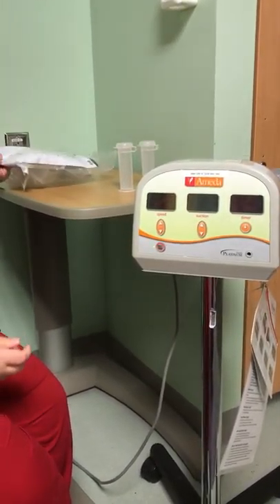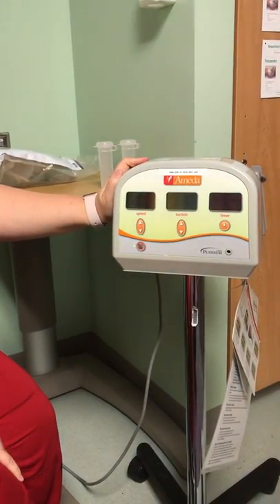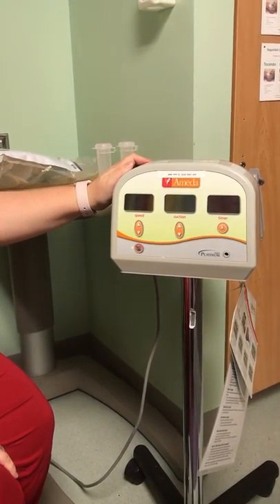We are going to review how to use the Ameda Platinum Breast Pump. It's one of the two Ameda breast pumps that we have in the Choa system.